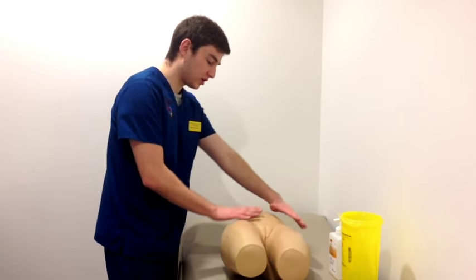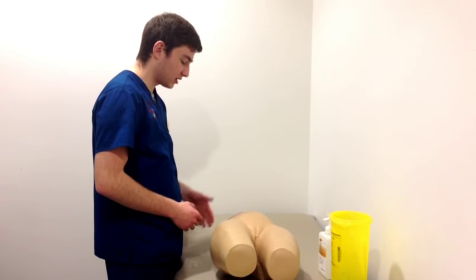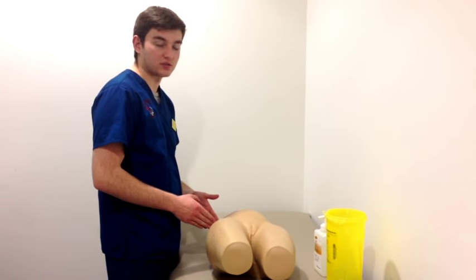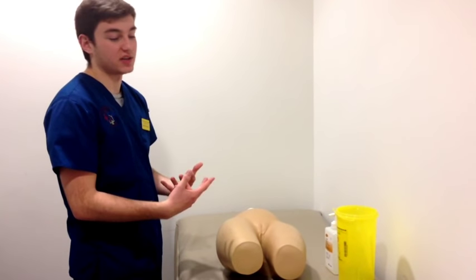So here, at the abdominal area exposed, the injection site is 1 inch away from the umbilicus on both sides, as well as from the costal margin down to the iliac crest. So it's kind of a square portion on both sides. I'm going to be asking the patient where he had the injection beforehand because I want to rotate sites.